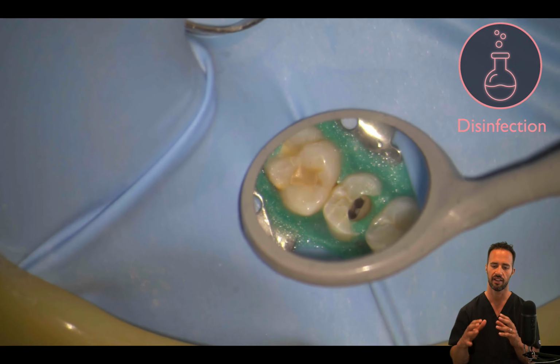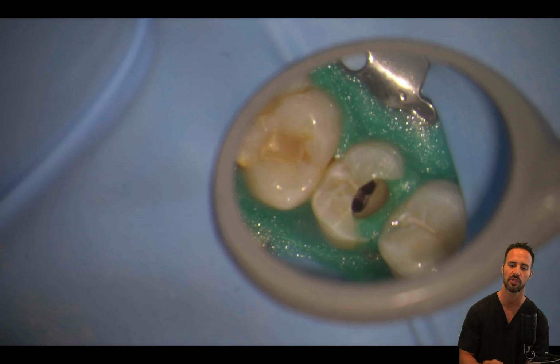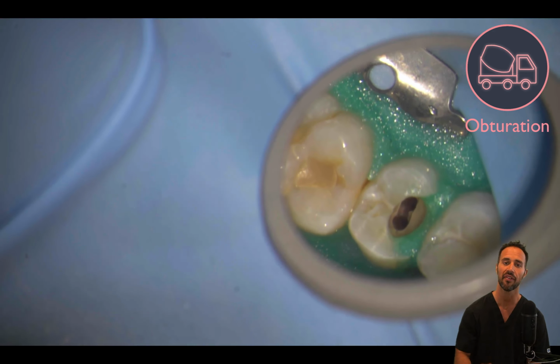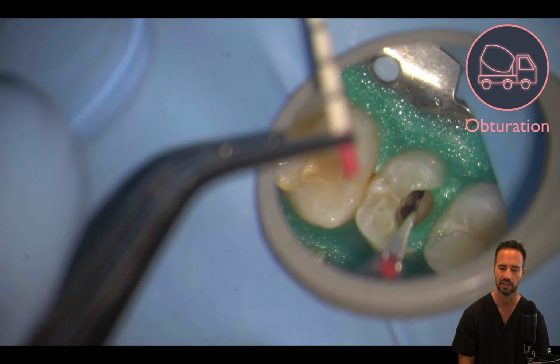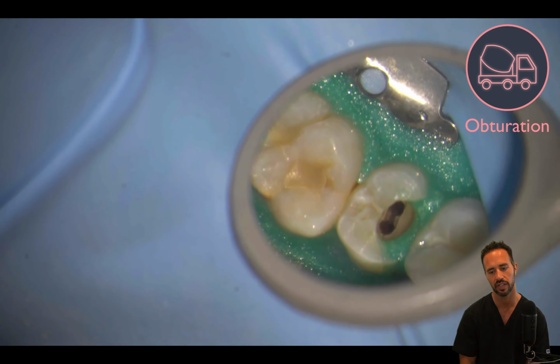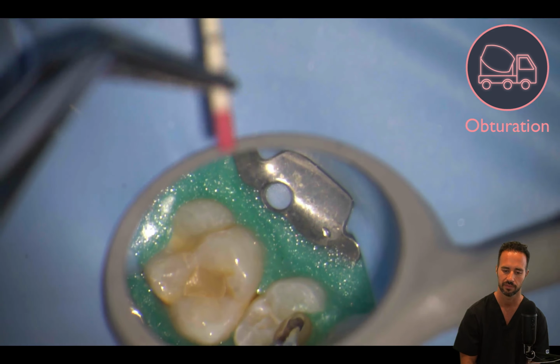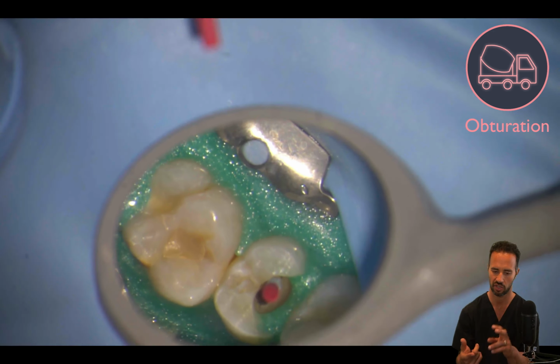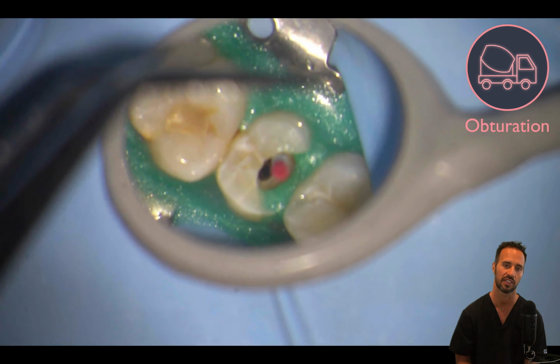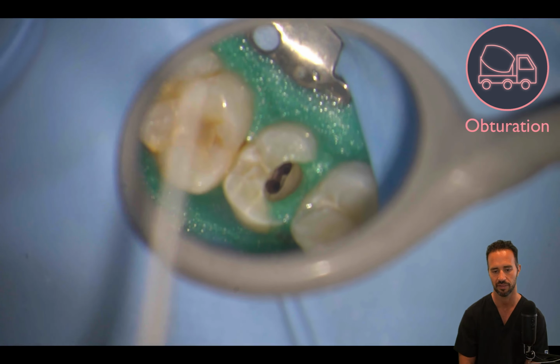All right, and that looks good, nice and clean. And now we're gonna proceed into our obturation phase of the treatment, and we're gonna be introducing our F2 paper points here in just a second. And the beauty of aspirating out the fluid is that we can get away with a single paper point typically per canal. All right, so it makes it very efficient on the materials side, and also efficient in terms of time, not having to use 5, 6, 7 paper points per canal, right?